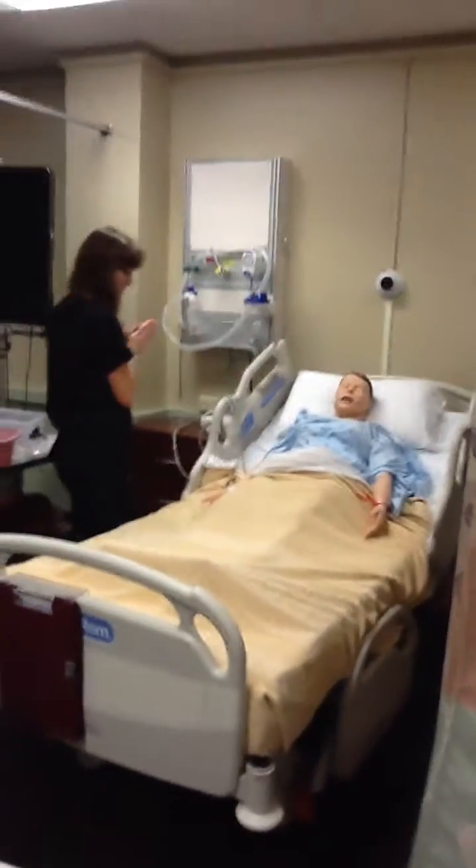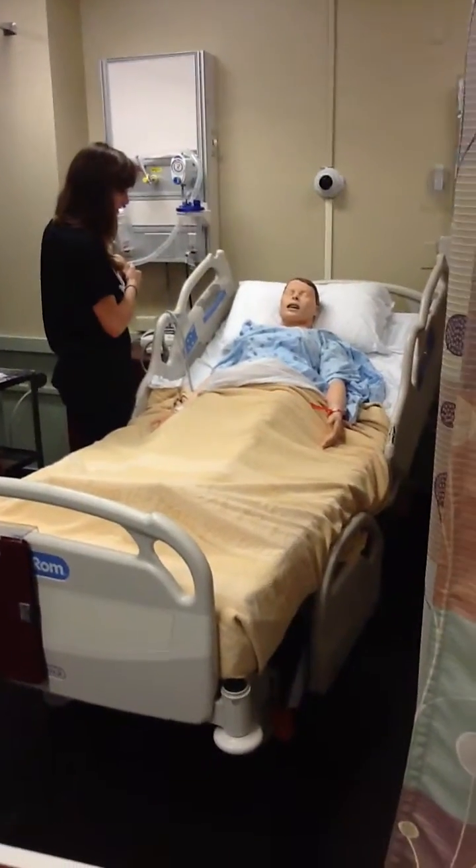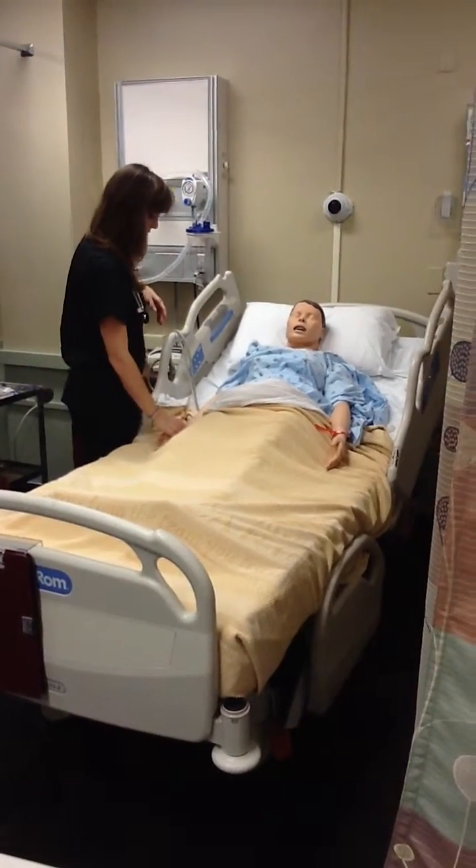Hi, I'm Mariah. I'm going to be your nurse today. Can I go ahead and start off with your name and your date of birth? All right, Mr. Monroe.